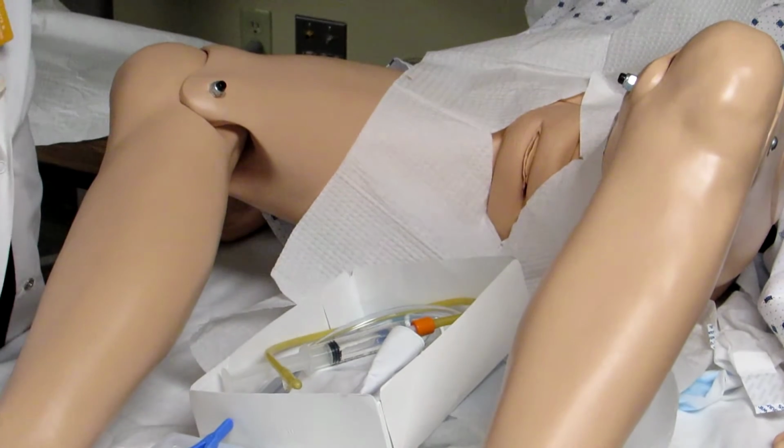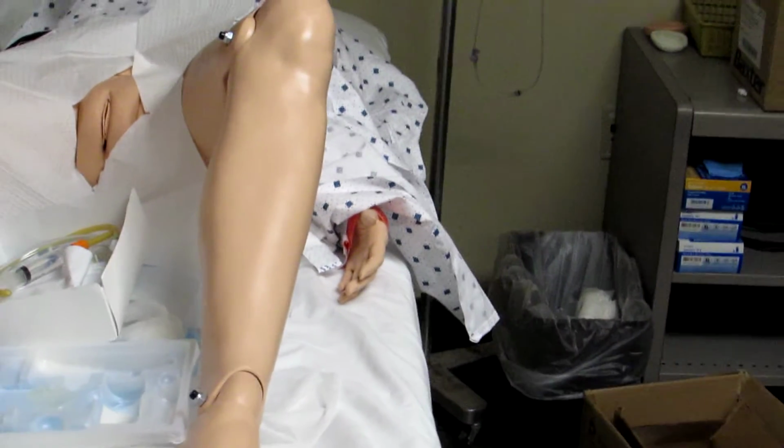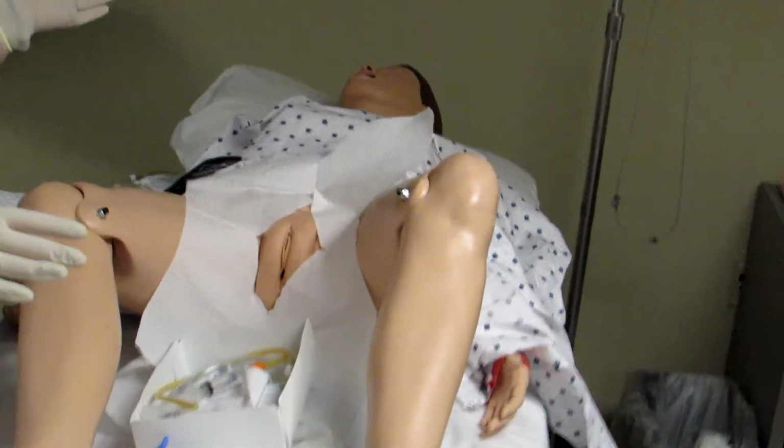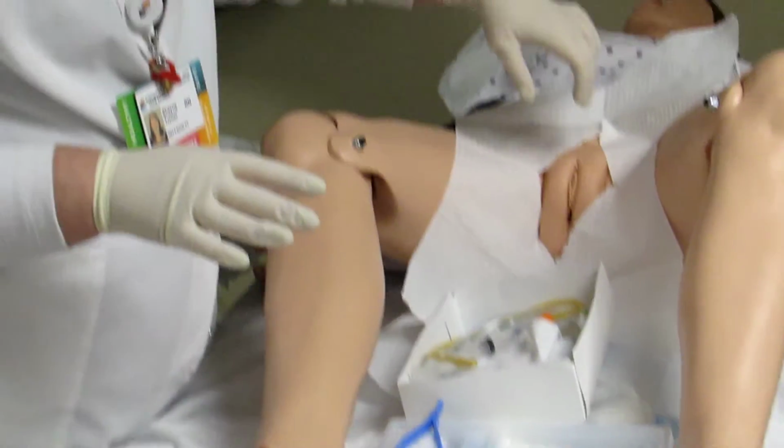At this point, you're ready to designate one hand dirty and one hand sterile. I'm positioned on the right side of the patient because I am right-handed. So I want to make sure that I'm going to have my left hand able to hold the perineum open and clean it, and my right hand is going to do the catheter insertion.